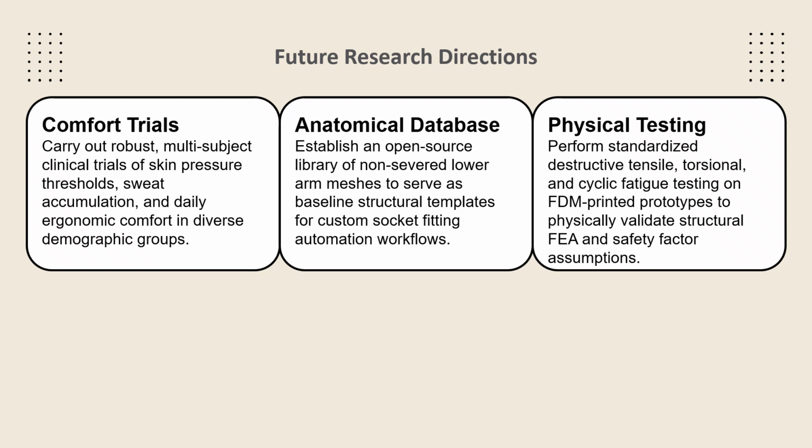Second, we will establish an open-source anatomical database of non-severed lower arm meshes. This library will provide the foundation for a base set of structural templates to drive automated algorithmic scaling and fitting workflows to accelerate the CAD stage.